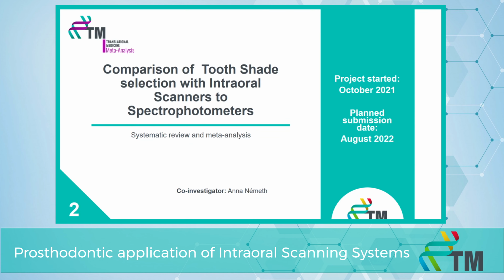My second topic is connected to the additional feature of intraoral scanning systems, which is the shade determination tool. So we want to compare the shade selection with intraoral scanners to spectrophotometers.